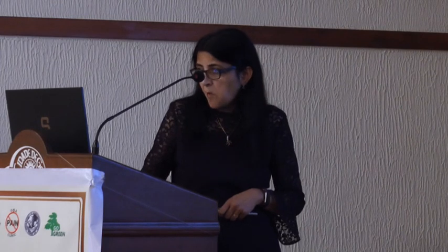as the nerve root will be enclosed in the muscle sheath. So again, just to show you how the C6 nerve root is visualized, large, it's often split into two elements. So it's quite easy for us to confuse it with C7, but it's actually bifid C6 here. Again, if you concentrate on this picture here, to find out where the C5 is, whether it's that or that or that, okay, it's quite confusing.